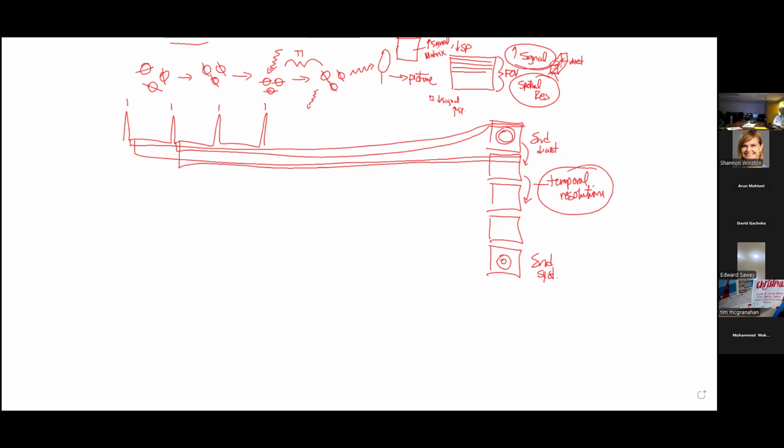Okay, so now this week, we're going to change and talk about how we measure blood flow. Corey, can you bring up a new screen? Because we're going to build on the principles that we learned previously. So first, what does flow equal to? Flow equals area times velocity.